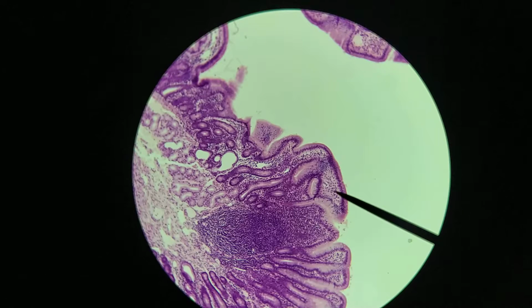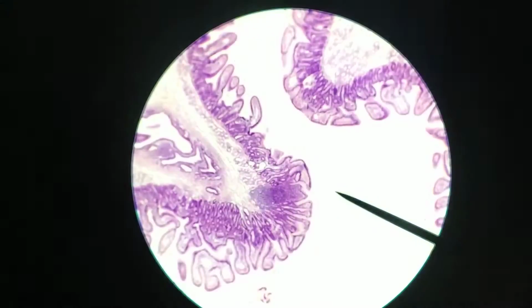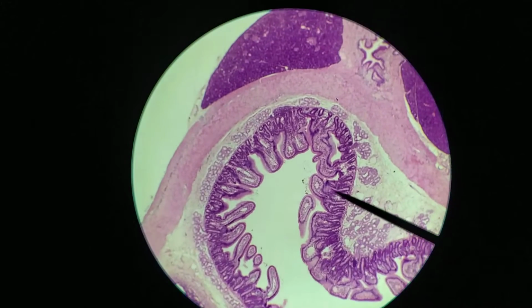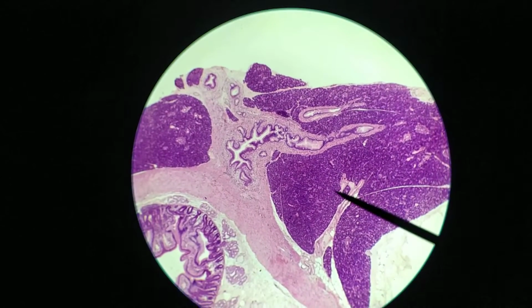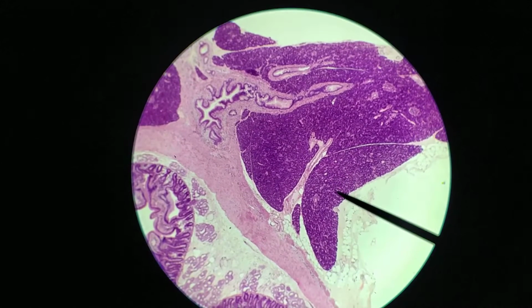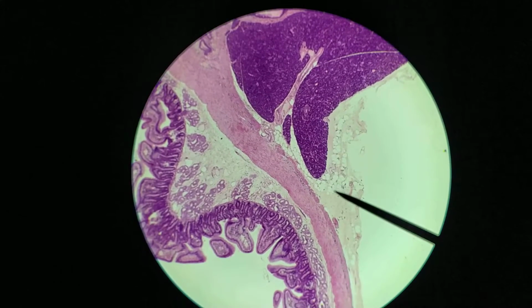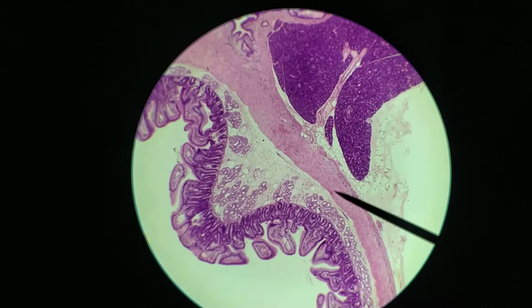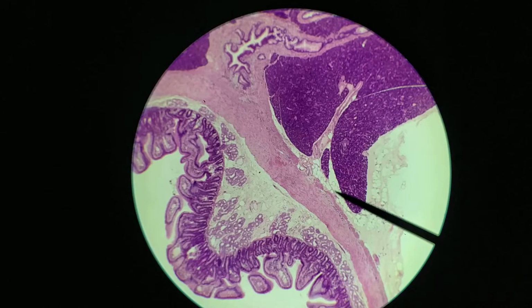just your primary point of defense. Okay. Now the other thing that is on this slide that tells me that we're looking at the duodenum is right here. This right here is the pancreas, okay, which is an organ that is just outside the duodenum. Now one thing to note here is that in this region here we have a connective tissue layer that is continuous between the duodenum, so in this region here, and the pancreas.